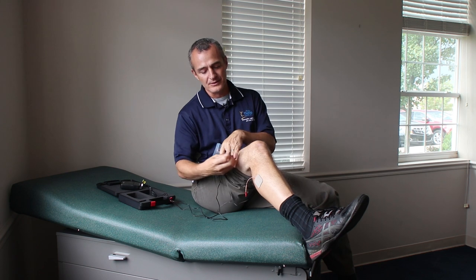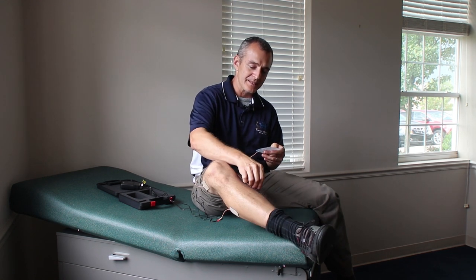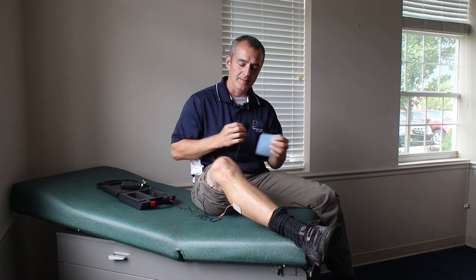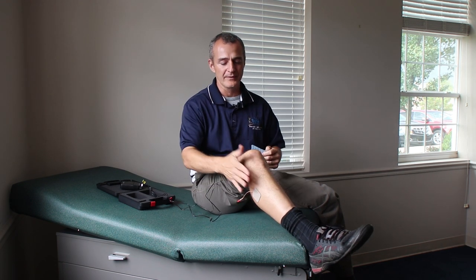On the same wire, I apply the other electrode above the knee, on the meaty part of the joint. Then I repeat the process on the other side — one electrode a couple inches below the knee and one electrode a couple inches above the knee.